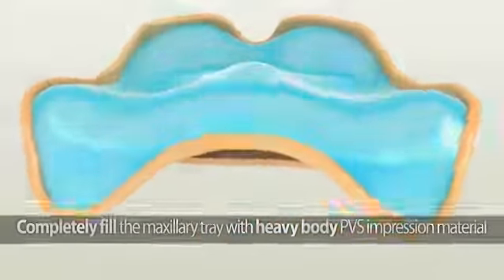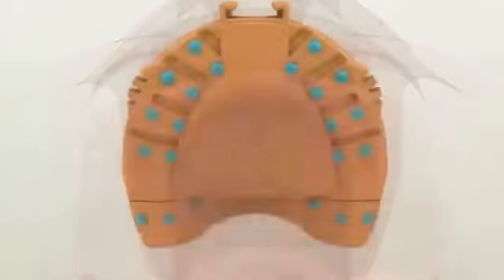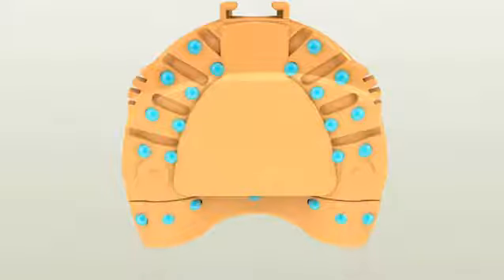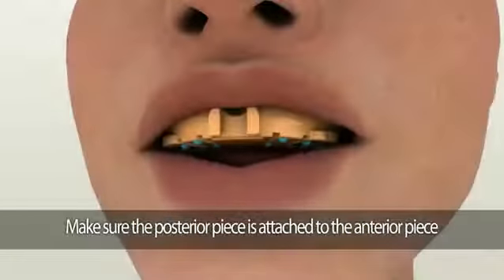Carefully insert the tray into the patient's mouth. To help with the complete seating of the customized Dent Cut tray, there will be finger spots on the back of the tray that allow you to apply pressure in the correct position. Firmly press the finger spots at the back of the tray to seat it completely.